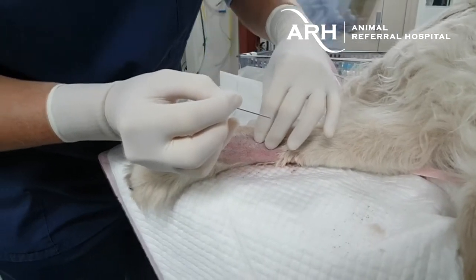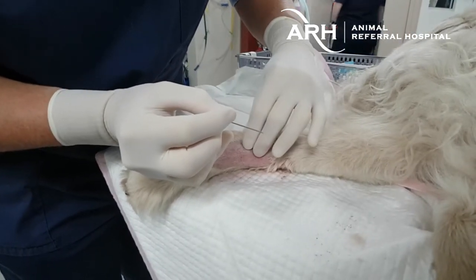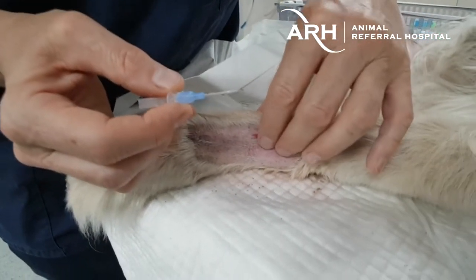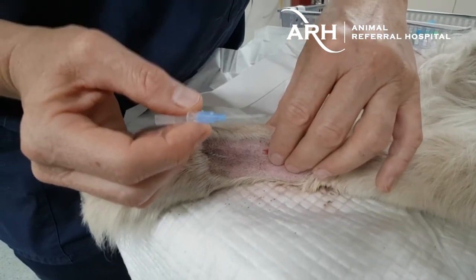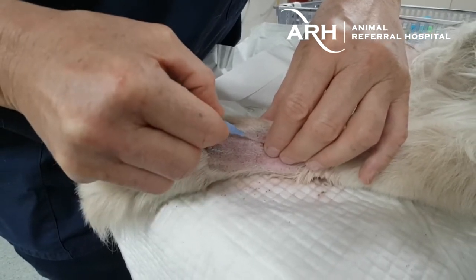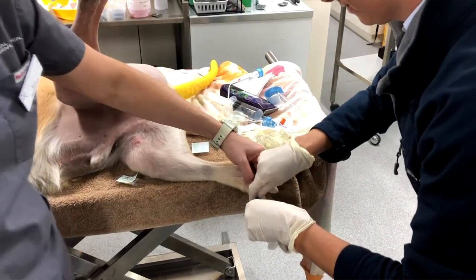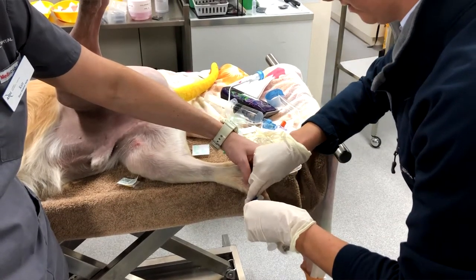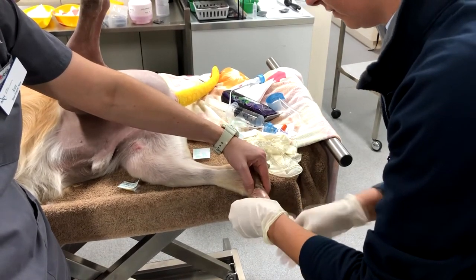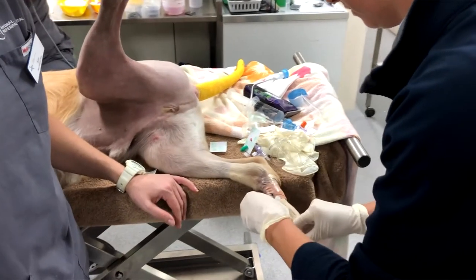It can be difficult to palpate once you've got gloves on, but wearing gloves is certainly considered gold standard. Once you get a flashback of blood, insert the catheter and you're ready to go ahead with invasive pressure monitoring. You can just tape it in with the three-way tap, and you'll see a big rush of blood confirming arterial placement.